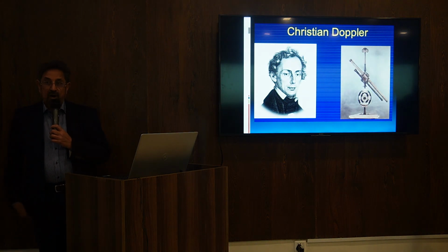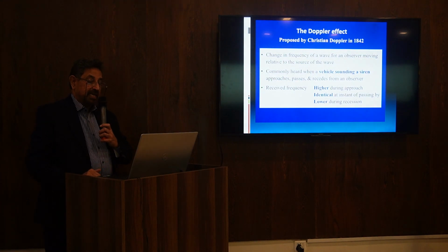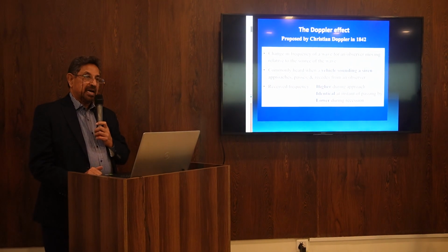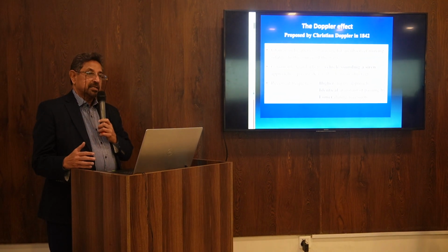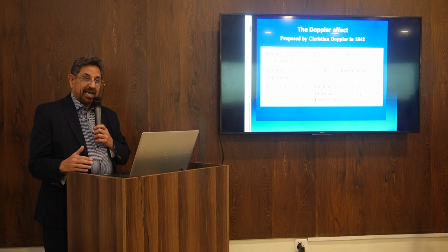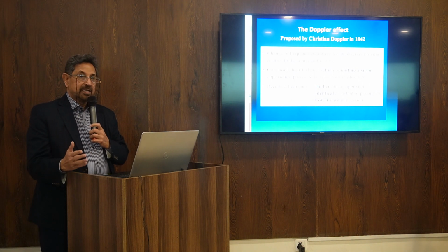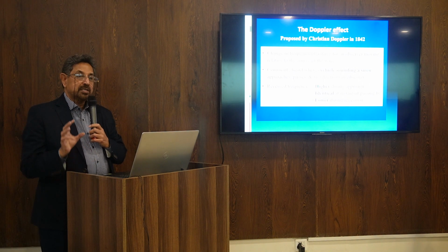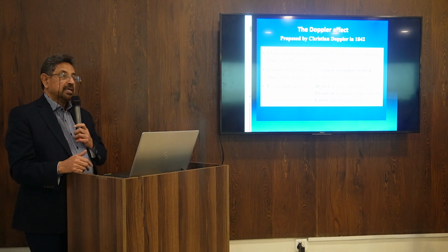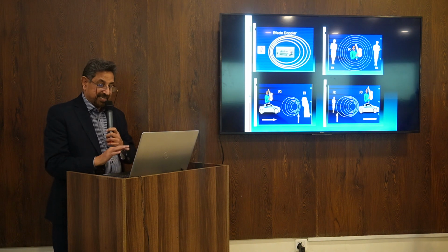Doppler. The idea of Doppler was evolved by Christian Doppler, a scientist, who said that when a sound wave is received by a person and the source is moving, like an ambulance siren or train siren, the frequency changes. If it's going towards the receiver, the frequency is increasing. If it's going away from the receiver, the frequency is decreasing. That's the basic idea thrown by that brilliant scientist.